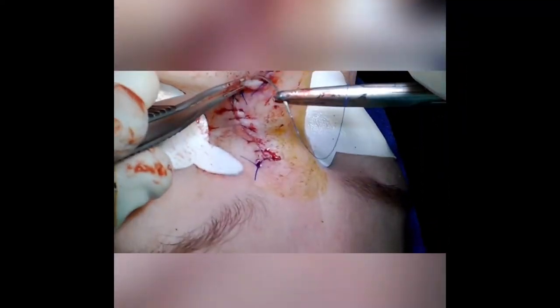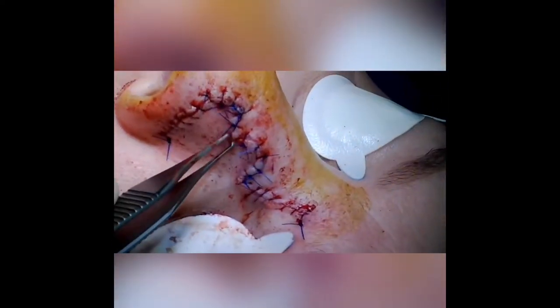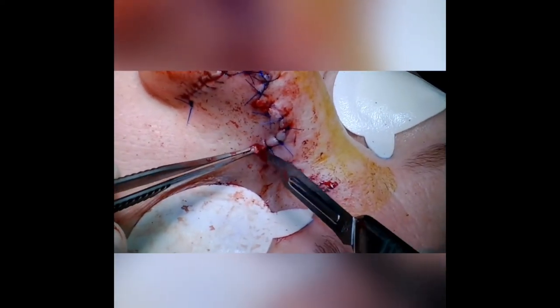We're finishing up the sutures, making sure all of the edges are everted. The patient will get instructions and we'll see her back in about a week to remove the Prolene sutures.